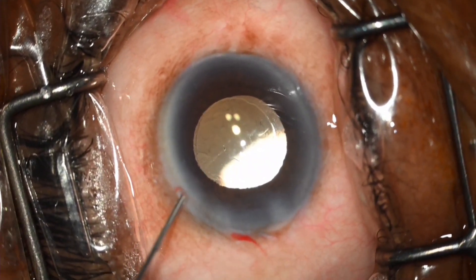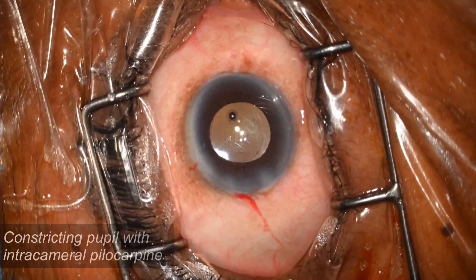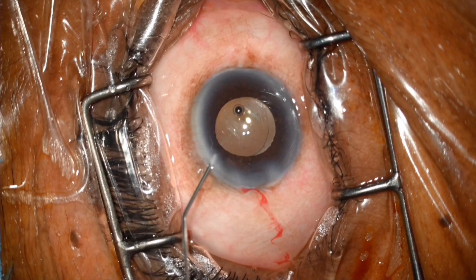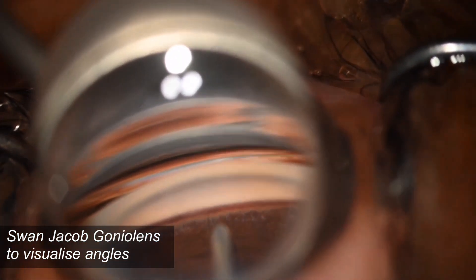In this video we can see that phacoemulsification has been completed and the pupil is being constricted with injectable pilocarpine, which is injected intracamerally. A Swan-Jacob gonio lens is placed on the cornea over a good amount of OVD and the angles are visualized.